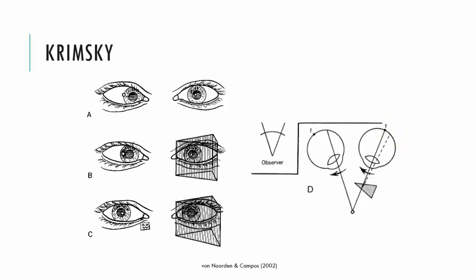Now, in that left eye turning in to take up fixation, we know the eyes need to move together. The right eye will move out. It will make a conjugate movement out. And so what we see here is that the eye is in, and when the prism comes on, the eye will move out. And progressively, as you increase these prisms, what will happen is the eye will progressively move out. That deviating eye will move out, out, out, until you're satisfied that the corneal reflection is in the correct position.